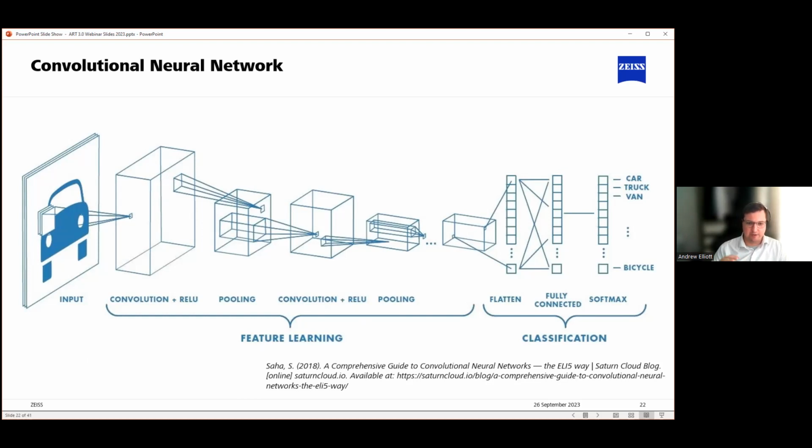And then the pooling is a little bit simpler. It's pretty much about just reducing again the size of your data. But throughout this whole process of convolution and pooling, it's keeping the actually useful bits of your information, so you're not losing any important information. It's just reducing it down to a size that is much more manageable for the neural network, because previously, without these steps, the amount of data the models were having to deal with was so large that building the models and reconstructing took a very, very long time. So by reducing the data without losing any essential data, these networks can operate much more quickly.